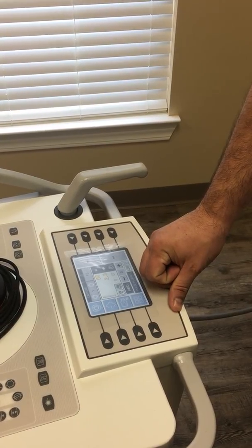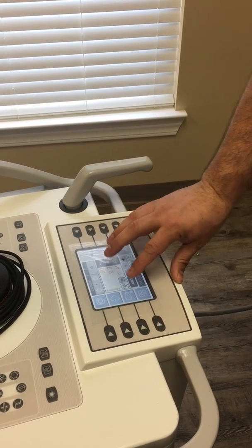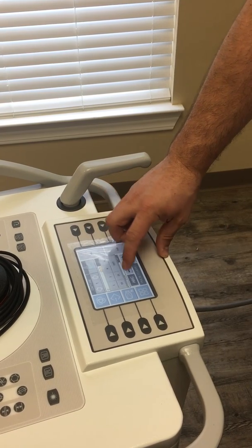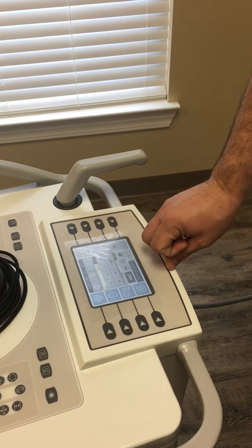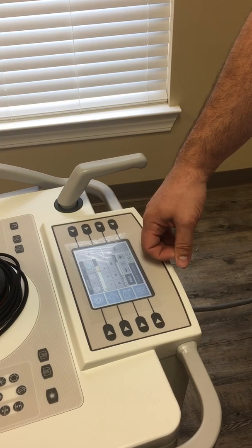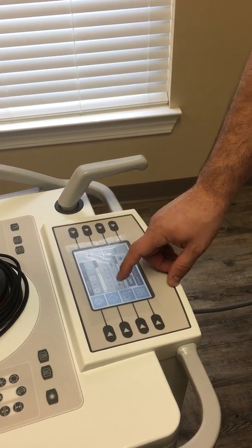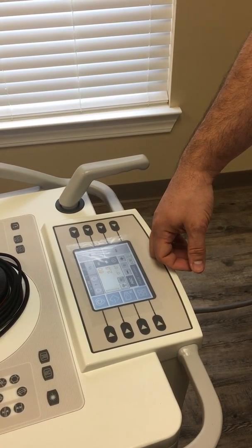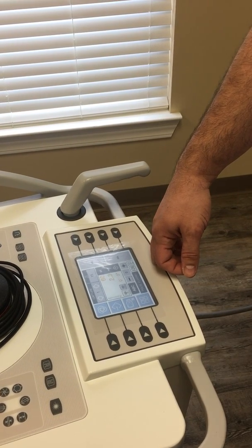Okay. All right. So with the other modes, you have a pulse mode. The pulse mode is pretty good for dose reduction. So it's variable pulses. Right now it's set at 15 pulses per second, and you can go in there and make an adjustment to it. If you shoot at like 25 pulses per second, your image is nearly identical to shooting in normal fluoro. However, it reduces your dose by like 35%. If you shoot at 15 pulses per second, the image quality is very comparable to normal fluoro, and it reduces your dose by like 45%, so it's nearly half the dose.